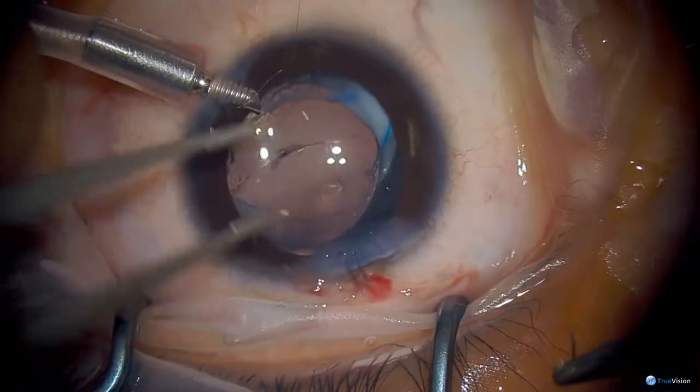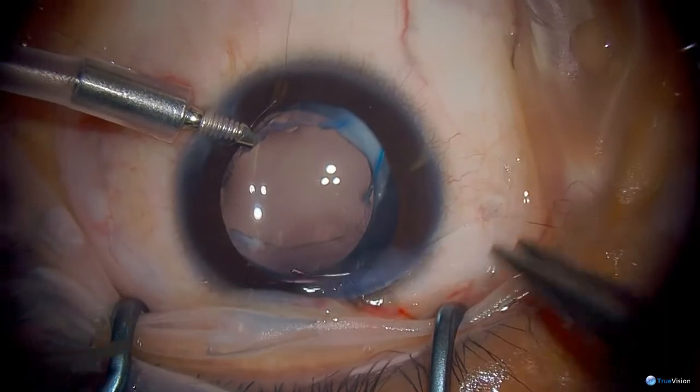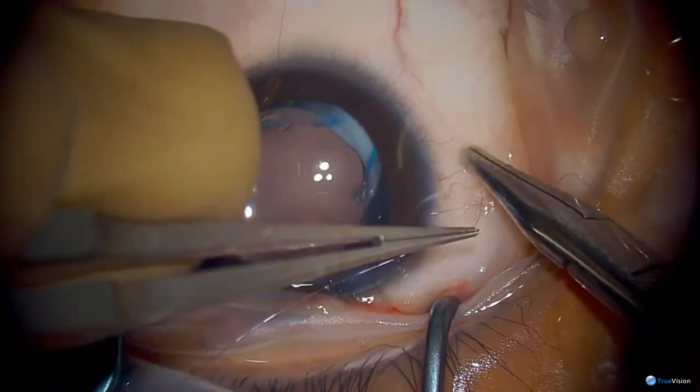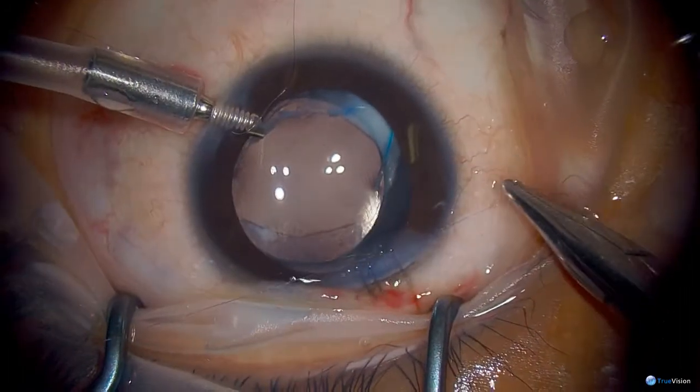Okay, so we're just going to suture, get the Tenon's again, which is going to suture the main wound. The reason for capturing helps keep the lens centered and also helps keep it away from the iris.